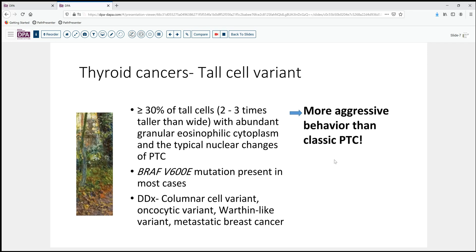The reason this is important is because these tumors tend to be more aggressive than classic papillary thyroid carcinoma. Therefore, an awareness of that, an awareness of the maybe radiation resistance or other features that these lesions may have, is important. The differential diagnosis is going to include the columnar cell variant, which does not have that same two to three times the height difference, oncocytic variants of papillary thyroid carcinoma, as well as a Warthin-like variant which has a lot of oxyphilic cells but also a lymphoid stroma. And then certain metastatic breast cancers can also appear similar to this tall cell variant as well.